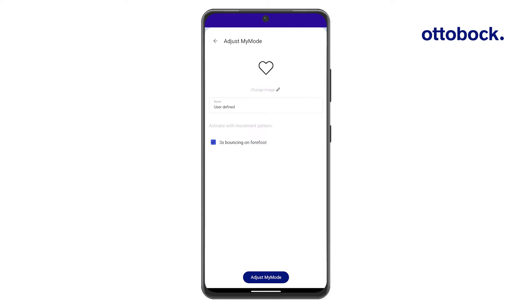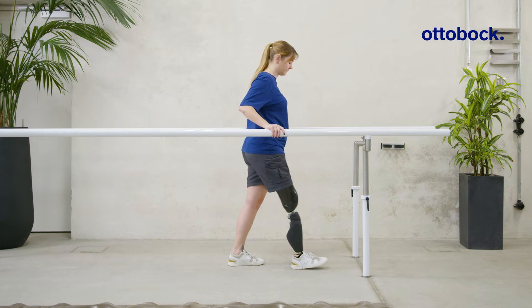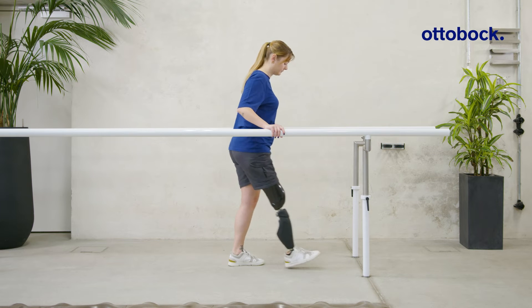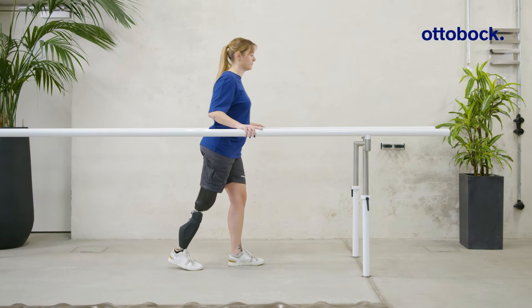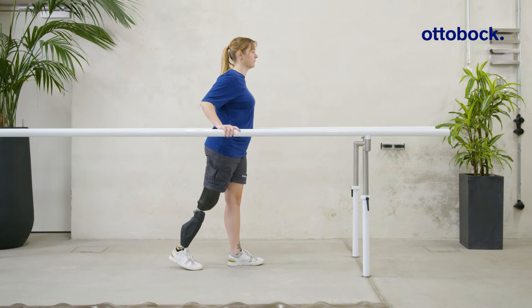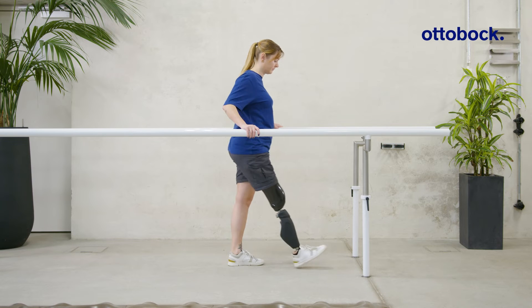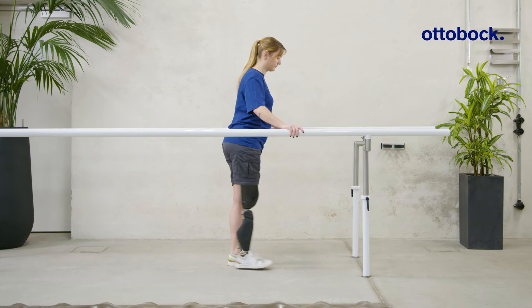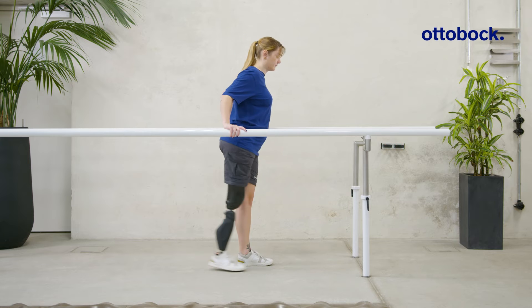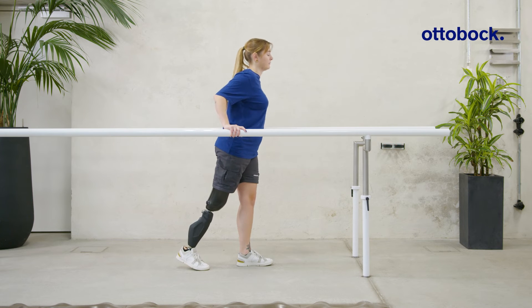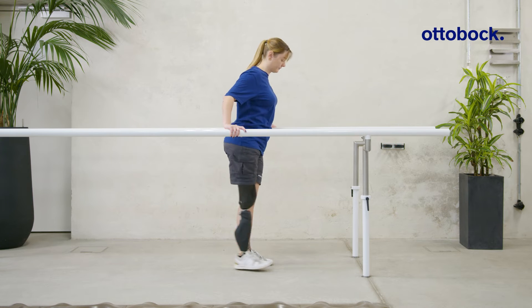Selecting the motion pattern allows users to switch between the Basic mode and a MyMode by bouncing on the forefoot, in addition to using the app. Repeating the motion pattern switches the knee joint back to Basic mode.